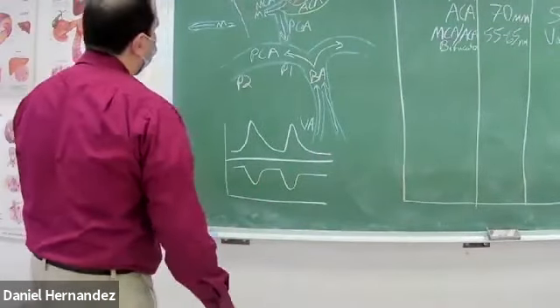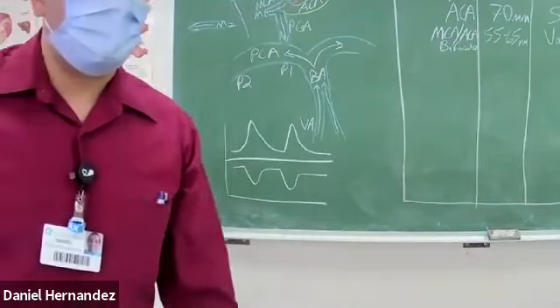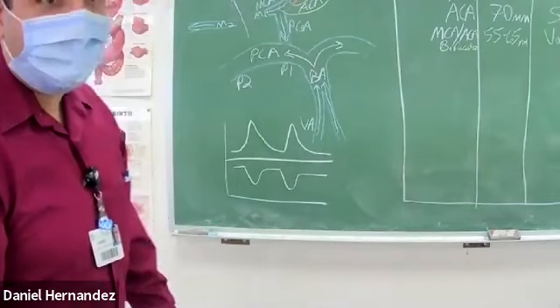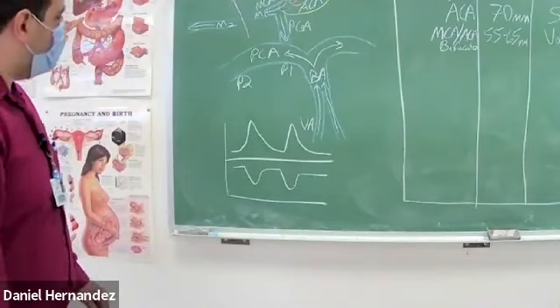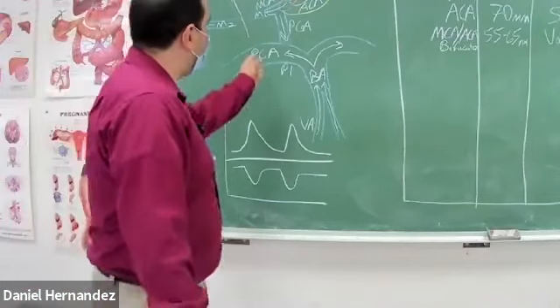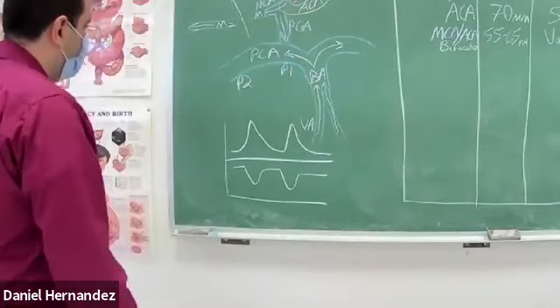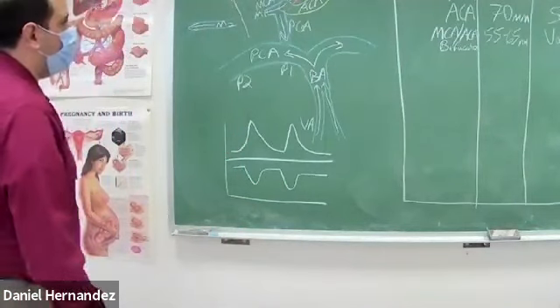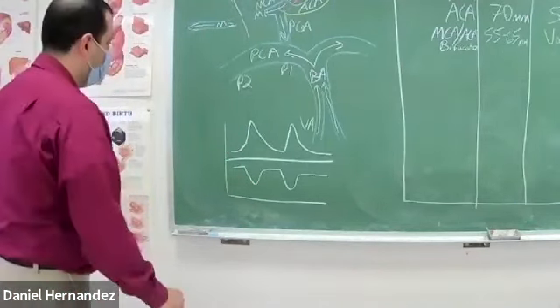So you're actually going to pick up both vessels, and that is used as your landmark. Back when we didn't have the imaging capabilities to visualize the vessels, the sonographer would use that bifurcation as your basis point to begin your exam, if you're able to find this waveform where you're able to image the bifurcation of both the ACA and the MCA.